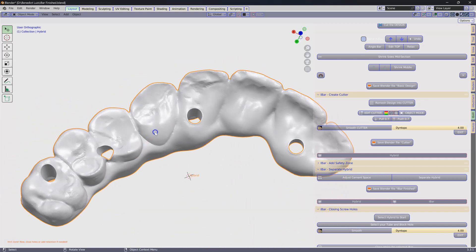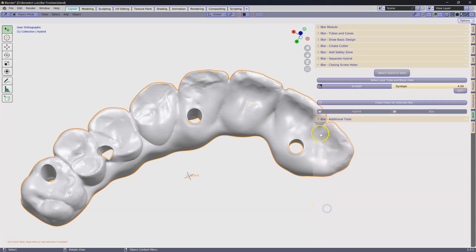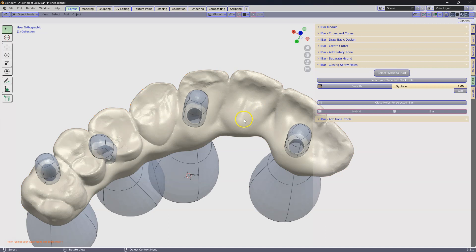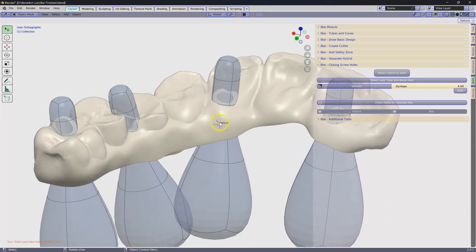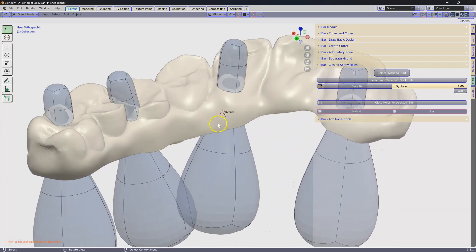Now I want to close those. Go to the next menu where it says closing holes. It says select hybrid to start. So we're going to select that and click on that button. This is going to expose our tubes.